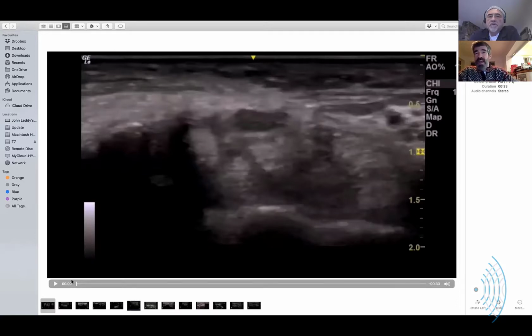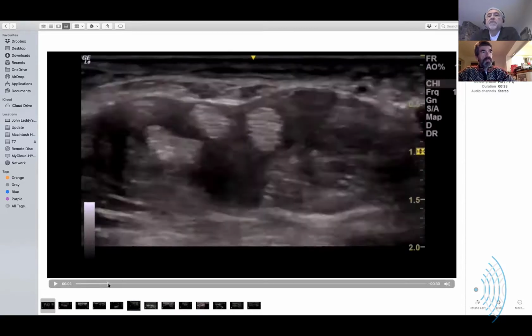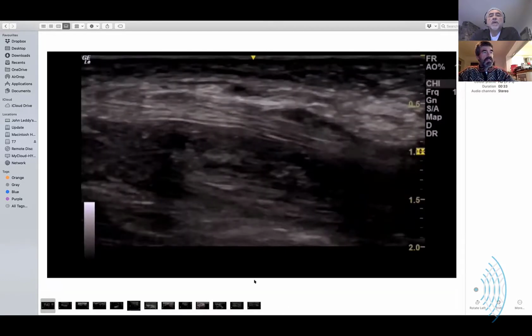And then checking, because sometimes it looks relatively normal coming into the tunnel, and it's actually when it comes out of the tunnel that it seems to be abnormal. On the distal end. Yeah. So once you come out from the area of compression, sometimes then it suddenly swells up, and that seems to be a less common, but potentially equally valid variant. Wow. So that was my unexpected synovitis in the tunnel.